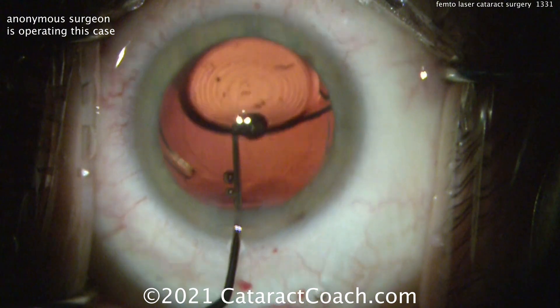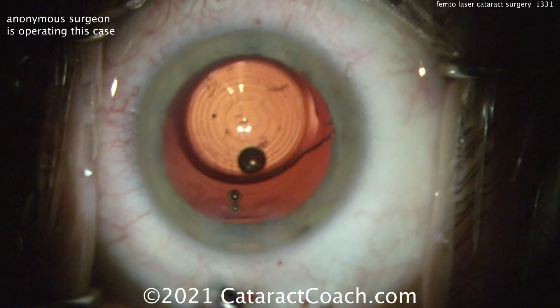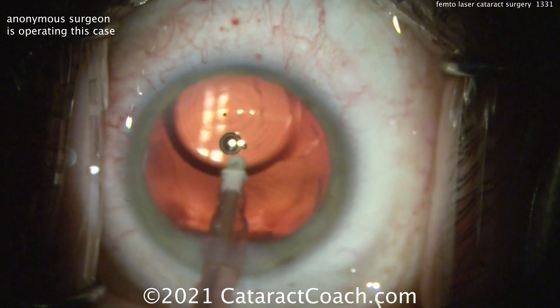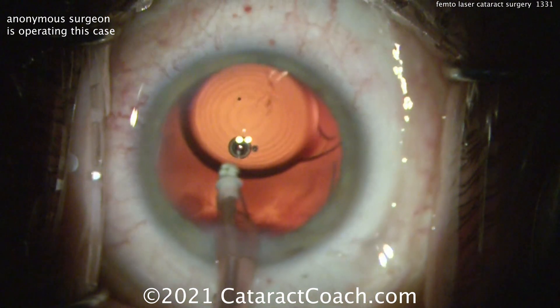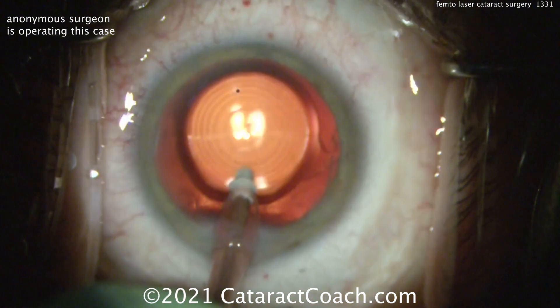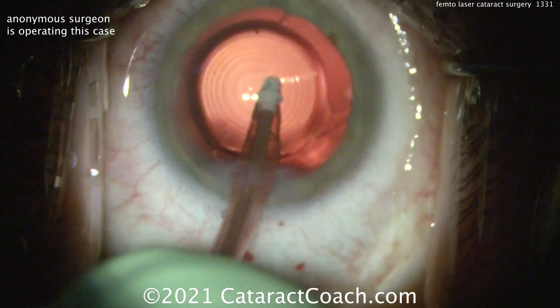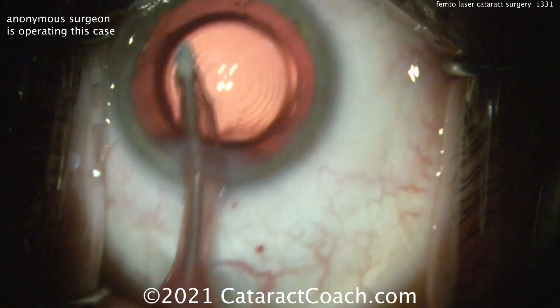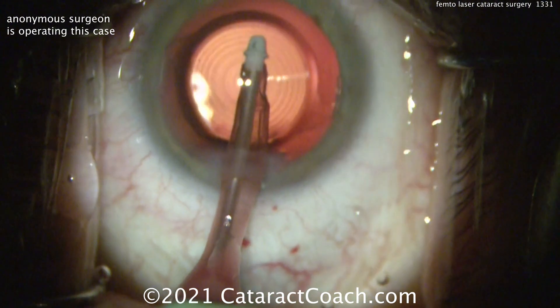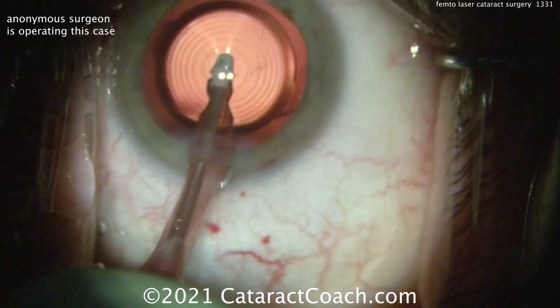So if you look at the lighting of this case — what else do you notice? The surgeon is using almost exclusively the coaxial lighting. You see how the view is just this central ring of light and there's not much around — the eyelids look very dark in the video. And if you look at the Purkinje images, you basically see just those two strong central lights and one tiny little peripheral light. The two strong central ones are the stereo coaxial in line with each ocular, hence the red reflex is very prominent. And that one very dim tiny light just to the side is the paraxial light, which is the overall outside lighting of the eye — very dim, which is why the video screen looks like this.